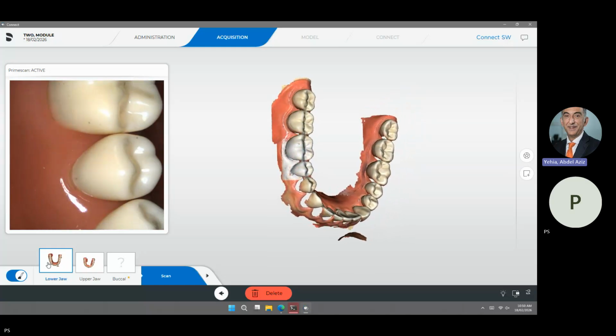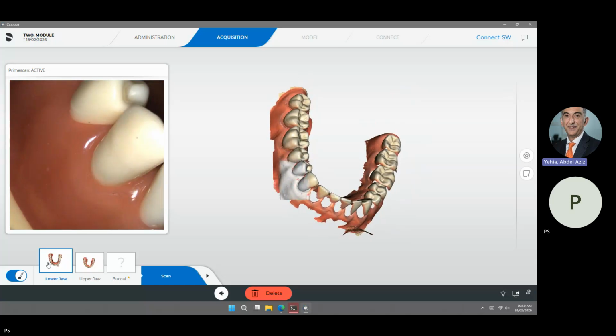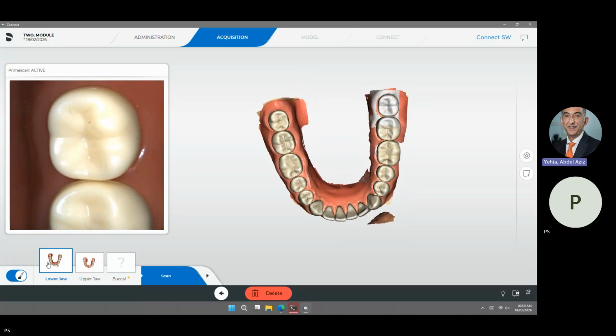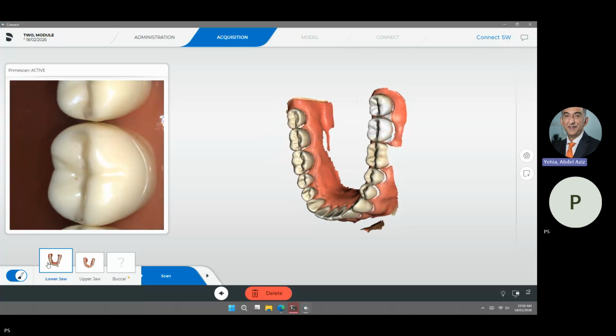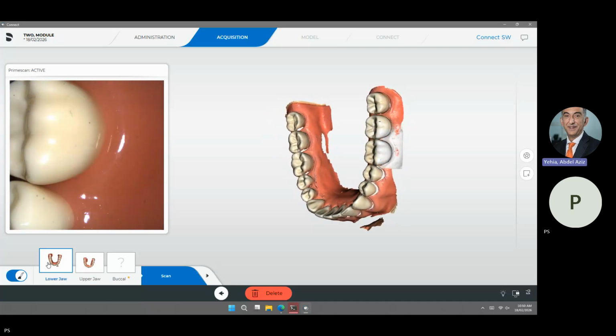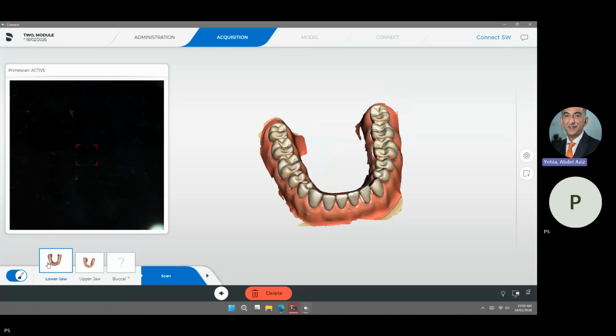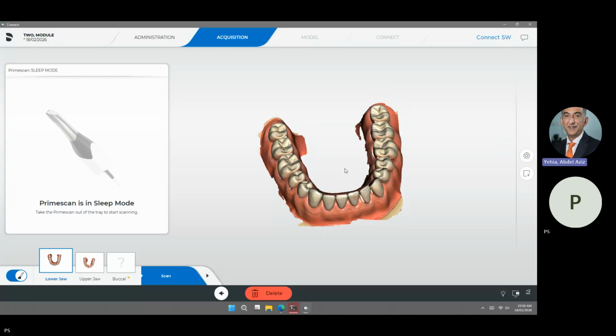One half is until the midline, and then I go from the last tooth on the left side and take the full labial area over here, okay? And this is good enough for opposing.